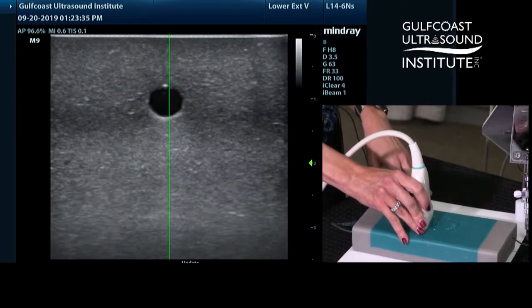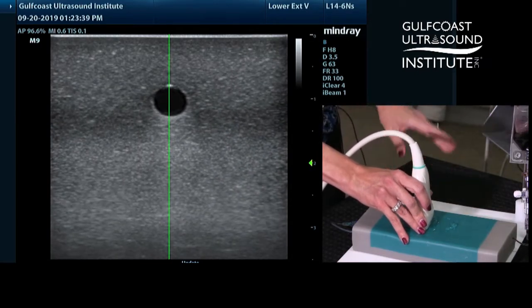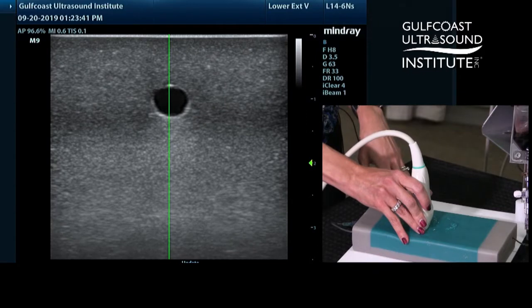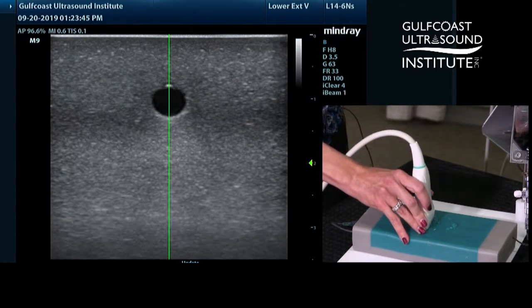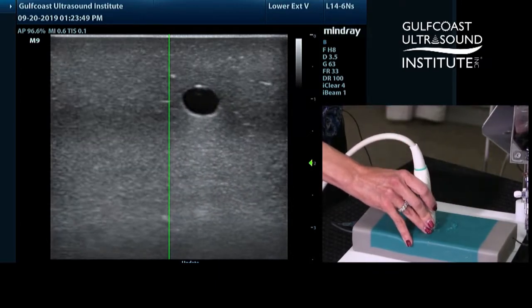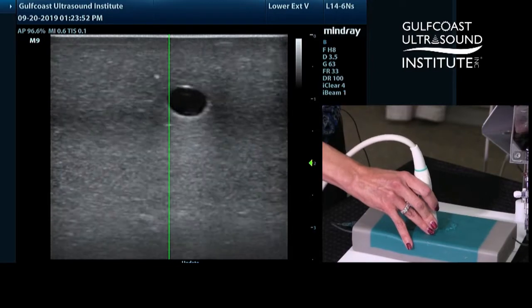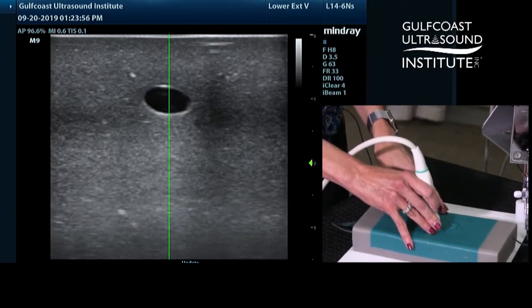In this case, I'm going to take the target blood vessel in my phantom and line it up on the M mode line. As I rotate the transducer, I need to make sure that my target — this blood vessel — stays on the green line. If I start to rotate the transducer only to find that my target is off, I need to go back and re-center the target onto the line before I continue the rotation.